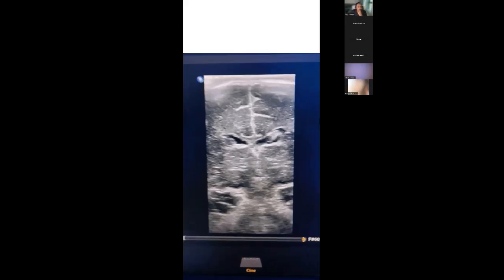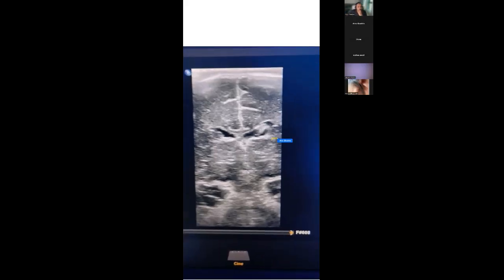If I say, it would be interesting. When you look at it there, whether this is the whole of the hemorrhage and you've got a little bit of cystic change there, so it could be a grade one. Could be. At the moment, I'd keep both possibilities. But I appreciate this, and a very nice follow up. With the linear views you can see the ventricles really nicely. You can see the meninges, the interhemispheric fissure, the calcarine sulci, which are usually seen in a mature baby.